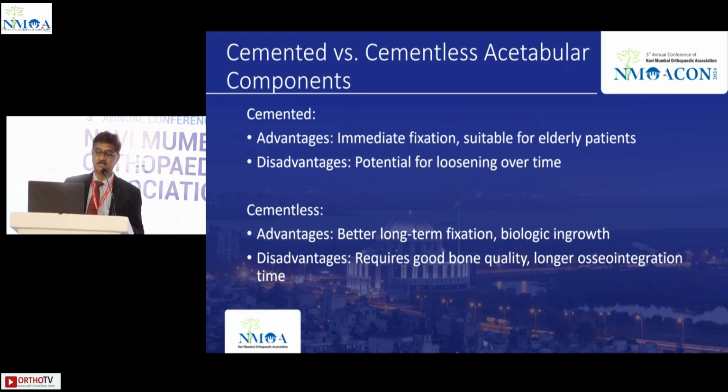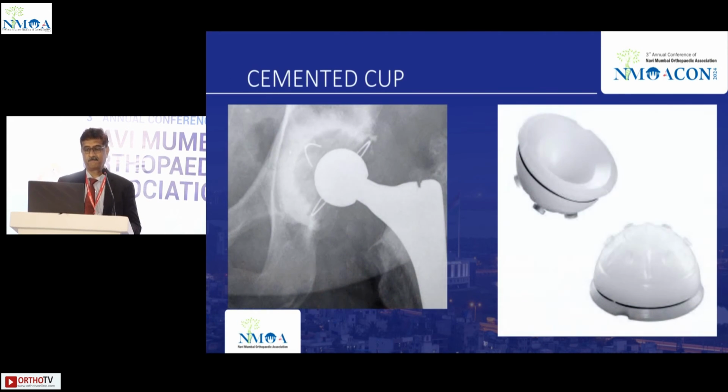Cementless cups, advantages are better long-term fixation and biologic ingrowth. Disadvantages are that they require good bone quality. In osteoporotic bone, the cup may be missing fixation, so we would like to avoid using it. And sometimes it takes a longer duration for osteointegration. So this is an example of a cemented cup.